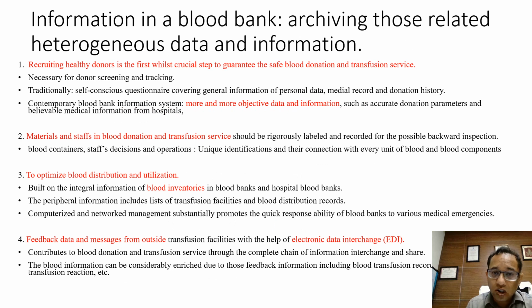With such a lot of information, all this heterogeneous data needs to be entered. One of the most important aspects is recruiting healthy donors. This part of the blood bank is very important, and it is necessary for donor screening and tracking.